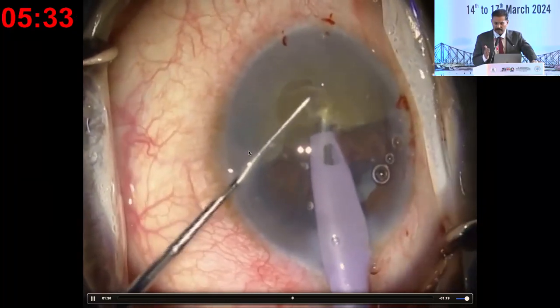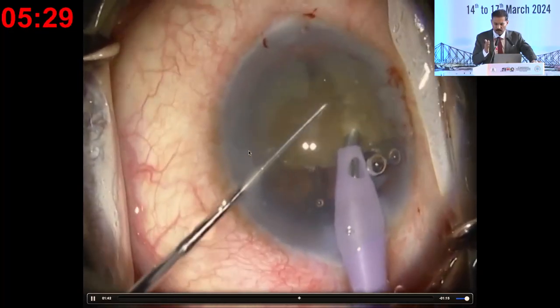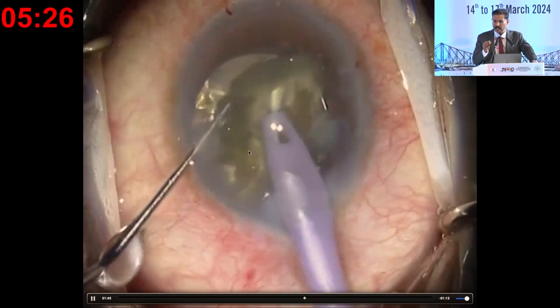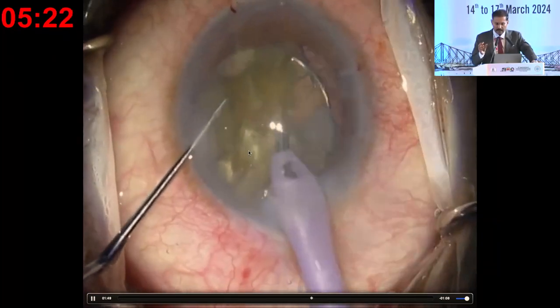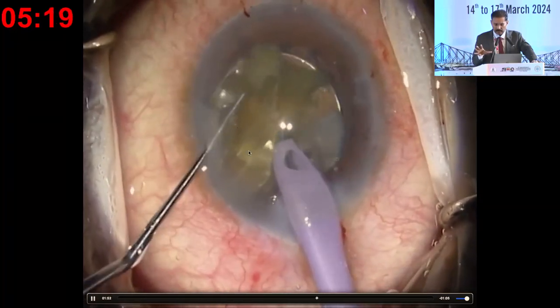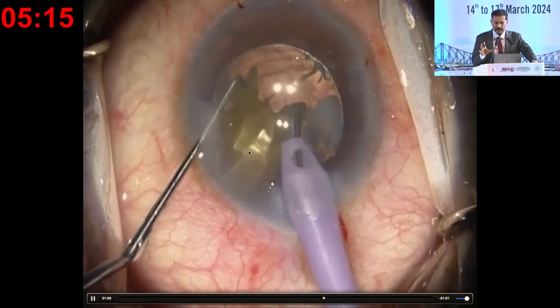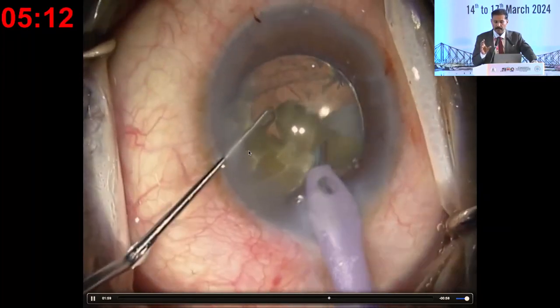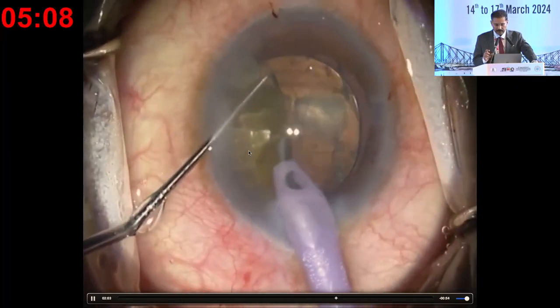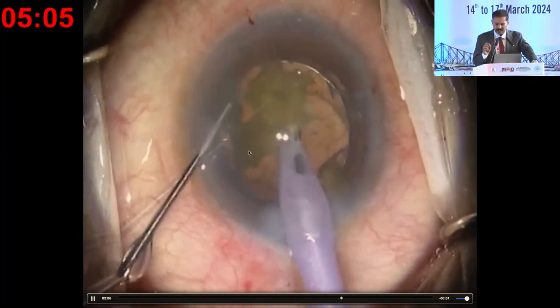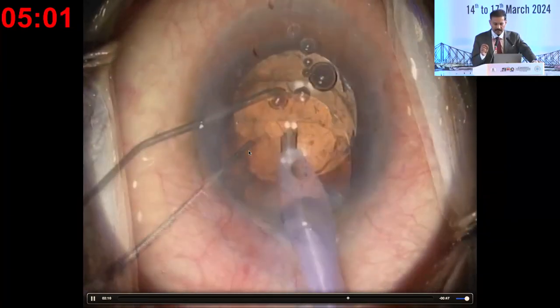You can notice that I am not splitting it very widely — in small chops, very small, mild separation — and then trying to eat off most of the lens part by part, not letting it go up. You can notice that the IOL is acting like a scaffold and it is preventing any nucleus piece from going down. That is the purpose of having the IOL there. Very gently, the movements are all very gentle, very slow. Take your time and finish off piece by piece and complete.